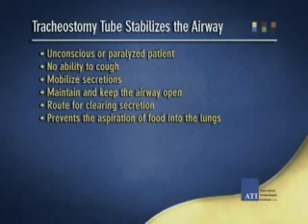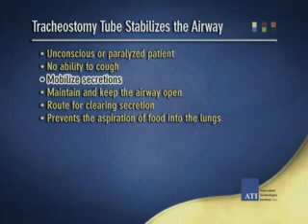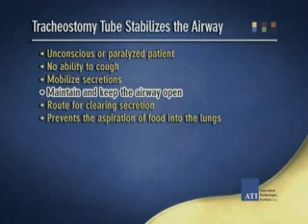A tracheostomy is the surgical opening into the trachea, allowing the placement of an indwelling tube to maintain patency of an airway. A tracheostomy tube might be inserted for emergency situations, such as airway obstruction due to laryngeal edema, foreign body dislodgement, or tumor. Or it could be used as an alternative to long-term artificial airway use, for instance, an endotracheal tube. A cuffed tracheostomy tube stabilizes the airway for an unconscious or paralyzed client who does not have the ability to cough, mobilize secretions, or maintain an open airway.